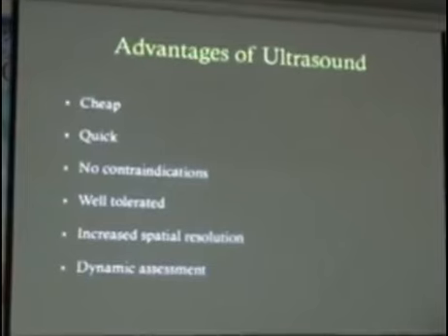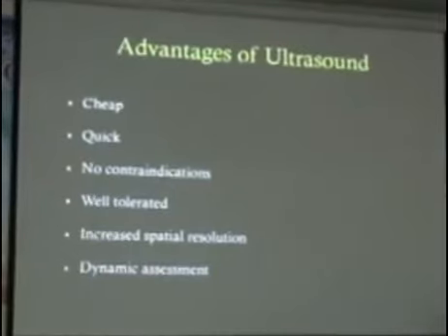But even so, ultrasound still has a lot to offer in terms of what we can see with ultrasound.